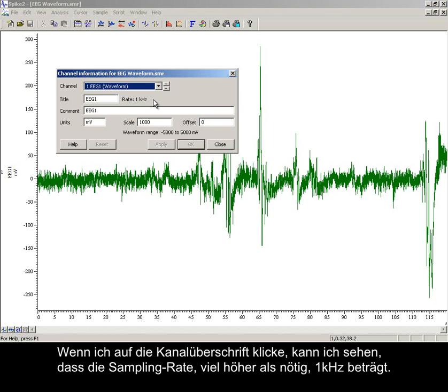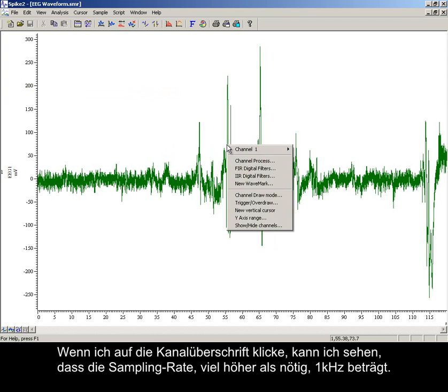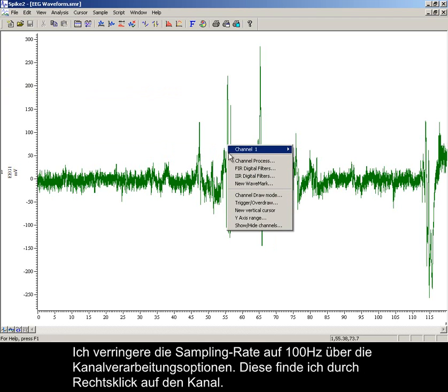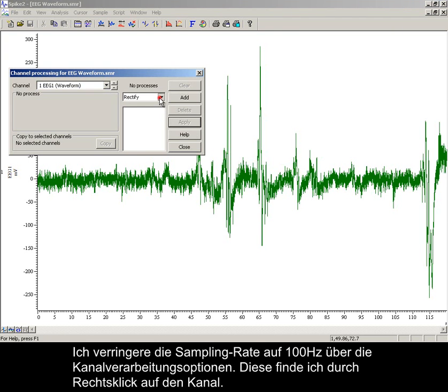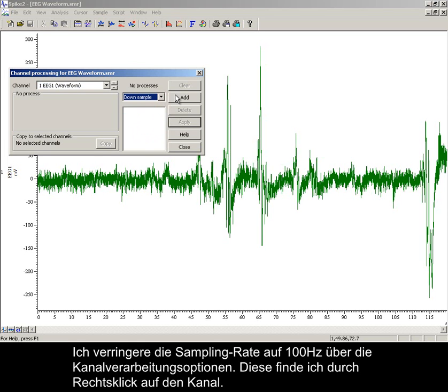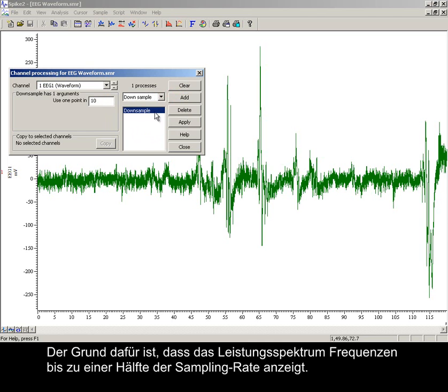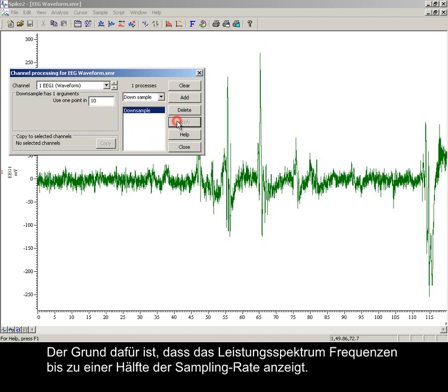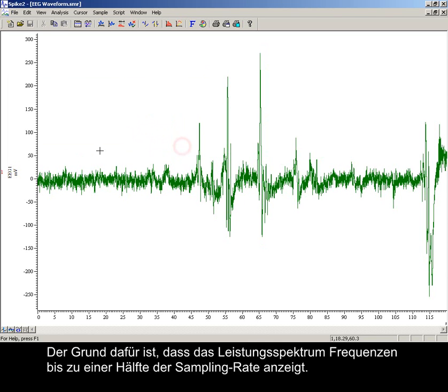Double clicking the channel title, I can see that the sample rate is 1 kHz, much higher than is necessary. I am going to reduce the sample rate to 100 Hz using the channel processing options — right click on the channel to access these. The reason for this is that the power spectra will display frequencies up to half of the sampling rate.